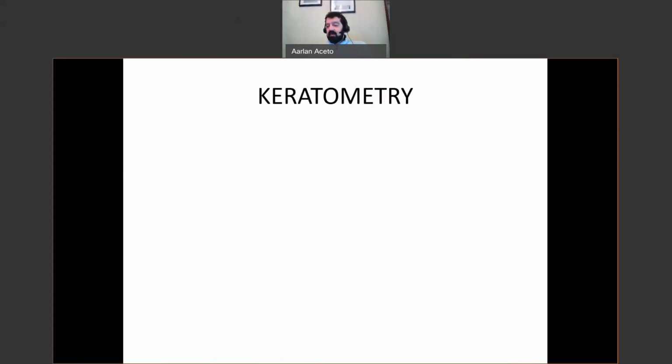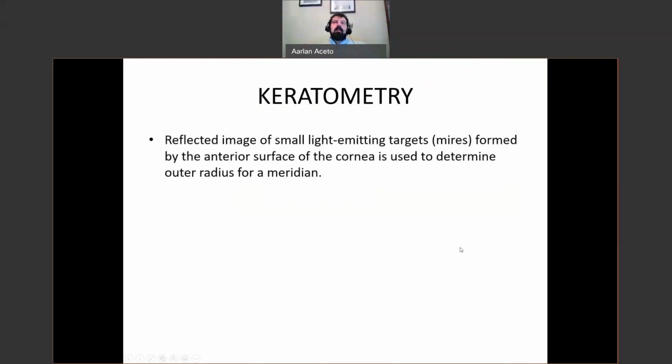So keratometry is simply the measuring of how steep, how flat is a person's eye. How much astigmatism, how much is the difference between one meridian and the other, what orientation. And if you'll start to recognize that the relationship there, we know with our lenses we can identify mixed astigmatism. We can identify compound and simple hyperopic and myopic astigmatism. Well, now we're going to start seeing how that actually matches up with corneal shape.